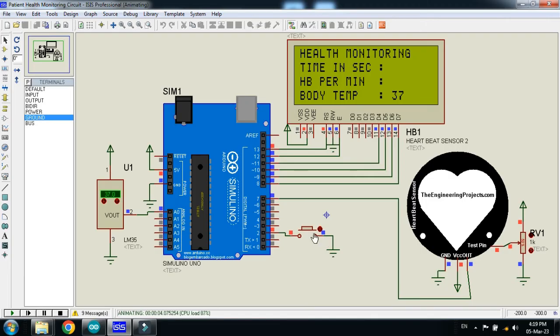Now run the code. You can see the temperature is 27 — let me increase it. Whenever I press the push button, it will start counting the heartbeat of the patient. You can see the timer has started, and after 10 seconds it will count the heartbeat of the patient. You can see the heartbeat is 24.